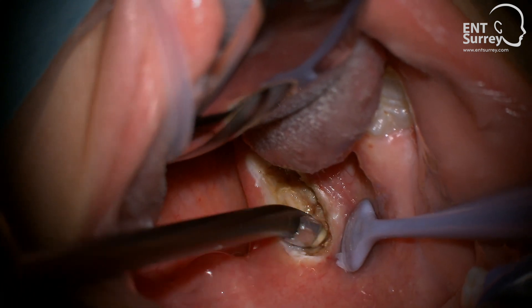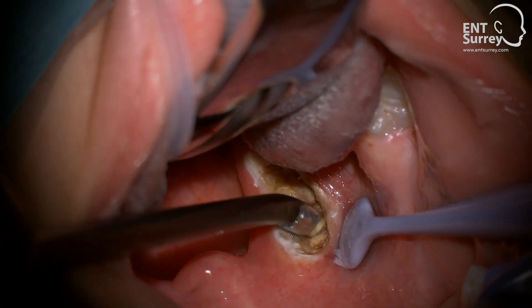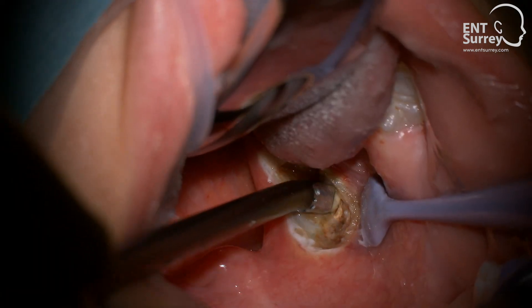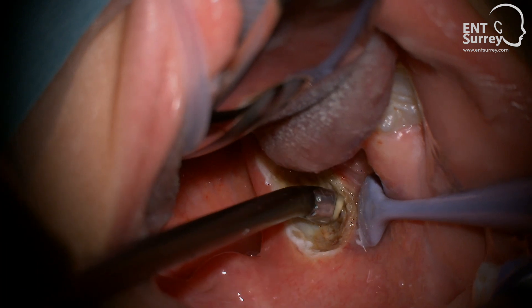I use repetitive motion in a stroking action whilst maintaining very gentle contact with the face and edge of the wand against the tonsil tissue to enable eradication of the tonsil crypts, while taking care not to traumatise the normal mucosa nearby. Sometimes debris can be seen as the crypts are removed, and this is cleared by the suction on the device.